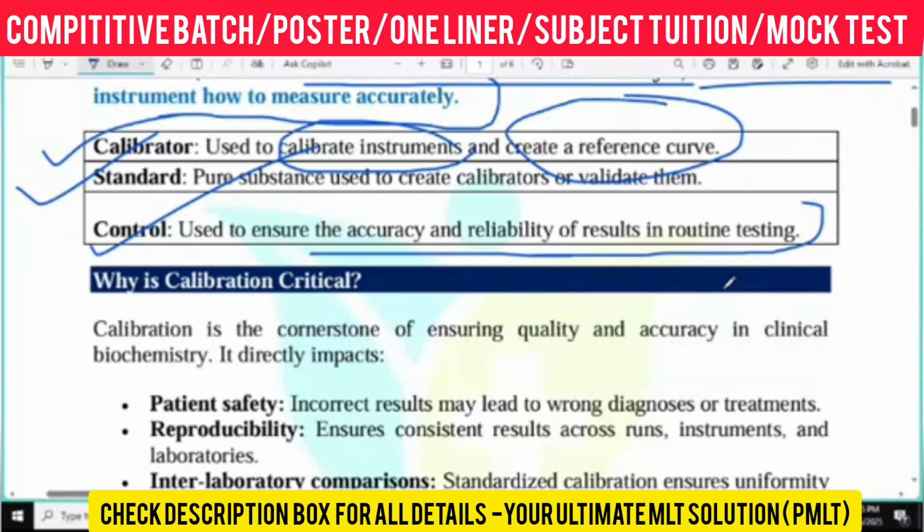Sir, repeat the calibration point. Calibrator and calibration are different things. Calibration means you are teaching the instrument how to work with this particular reagent. That is calibration. And the analyte you are using for doing the calibration is called the calibrator. Understood?